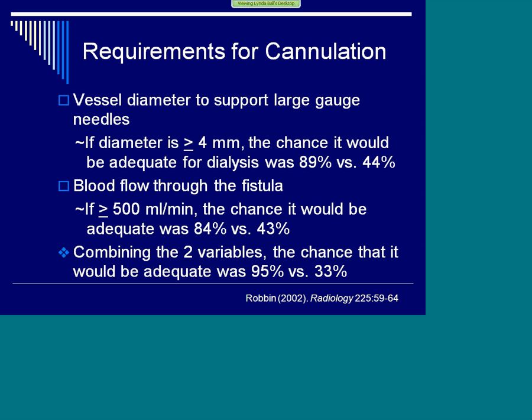So that's something that they can do now where they don't have to go back in and open up the patient. They can feed this in right in through the fistula. And what you might notice is that sometimes if you're palpating around the fistula, you might be able to feel the coils. They might feel like little hard spots. You might also notice that right after the procedure, they might have reddened areas. And that's kind of an inflammatory response, and that usually will go away after that.